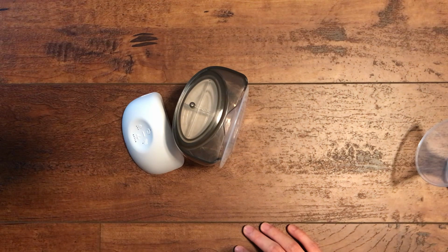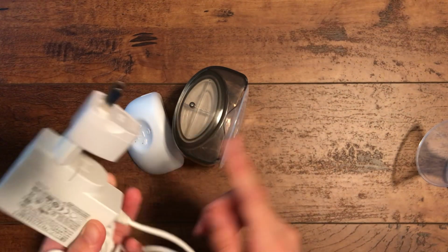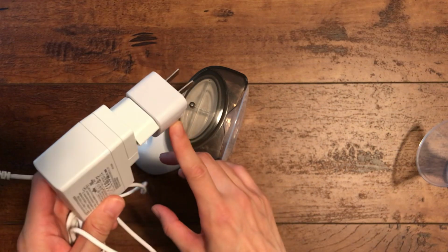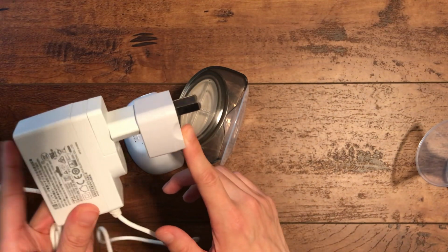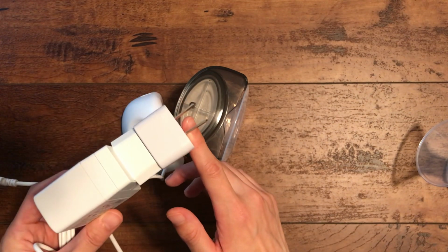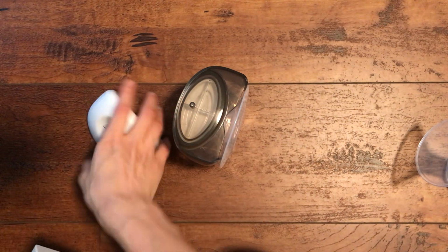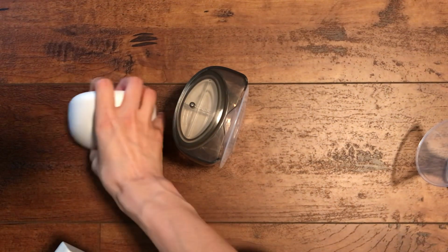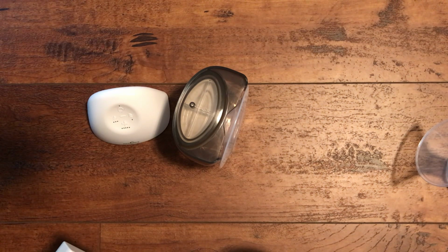And then I wanted to go over the charger a little bit, because in my last video I talked about the charger. I wanted to clarify that in the last video I had struggled with putting this adapter into the charger, but it did fit. It ended up fitting. It was just hard to push it in initially. So you can buy one of these things on Amazon. I think they sell for maybe like $7 for 2 units. So you can buy this, or this pump uses a USB Type-C cable, so you can just purchase one that is compatible with American voltage. You can do either way. So I want to just clarify that the adapter worked in the charger.